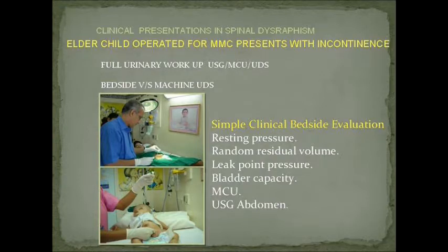This can be done 2 or 3 times when they are admitted in the ward, and we try to find the resting pressure, the importance of which has been emphasized by every speaker in the morning. We measure the random residual volume, the leak point pressure, and the bladder volume, if we don't use the word capacity. And of course these other tests are done.